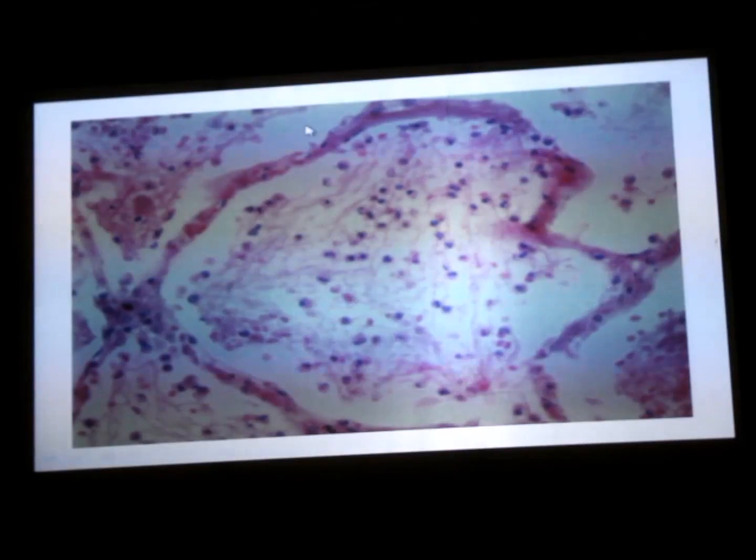If you see such appearance, you should write it is lobar pneumonia, affecting a lobe of a lung. Bronchopneumonia affects patchy areas, wherever there are bronchi or bronchioles, the area surrounding this, including the lobes. So it is patchy, whereas here it involves a lobe or multiple lobes. So alveoli consisting of exudate and inflammatory cells.